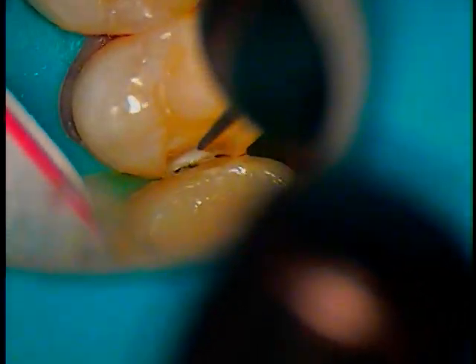I'm going to get my extension through the contact of number 3. And here we go. It's a little different from traditional amalgam preparations, where you've got to reduce more tooth structure. So we're staying conservative and basically just producing a box. There is an old composite there. I'm going to go ahead and treat that as well and leave no stone unturned.